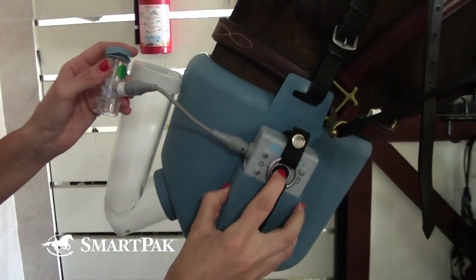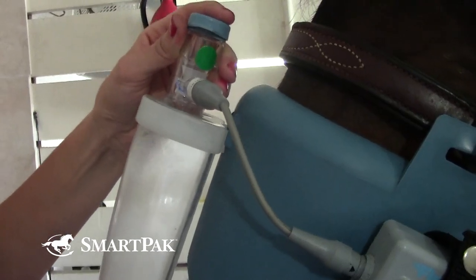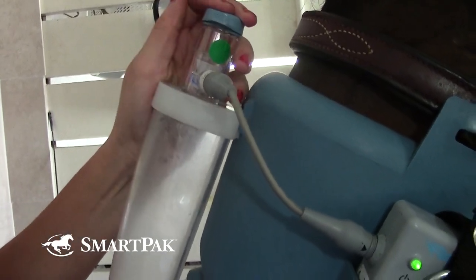Once you've worked with your veterinarian on which medication is best for your horse, you will order your Flexinib nebulizer. The two things that you will need are a syringe and needles to be able to mix the medication with the saline. The saline already comes with the nebulizer, so you don't have to worry about that.